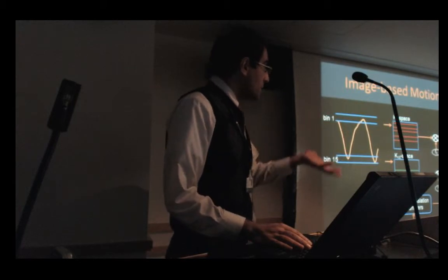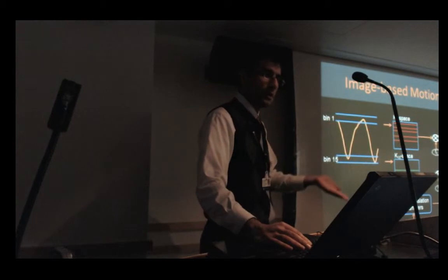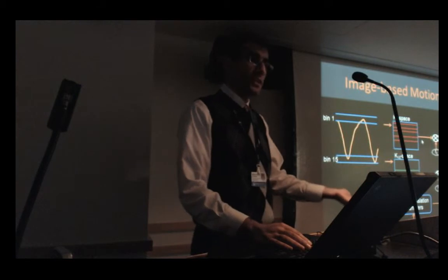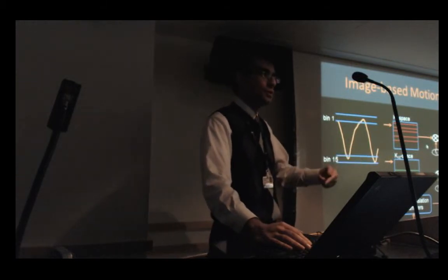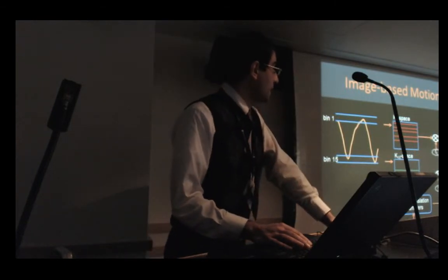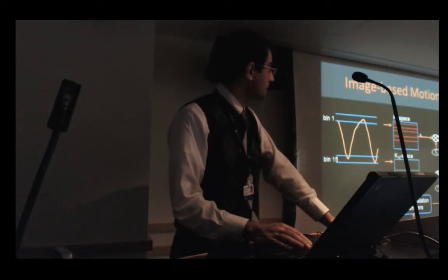If I combine all these K-spaces together, I would have a motion-corrupted image because some of the K-space lines are acquired at this position, at this respiratory cycle. Some of the K-space lines are acquired at end expiration. So if I combine those together, I would get a motion-corrupted image. And we know that respiratory motion shows itself as a blurring and ghosting artifact. But we saw that the respiratory motion can also be modeled by translation parameters, right? It was mainly a translation along the superior-inferior direction. And translational motion only affects the phase of K-space. It doesn't affect the magnitude.